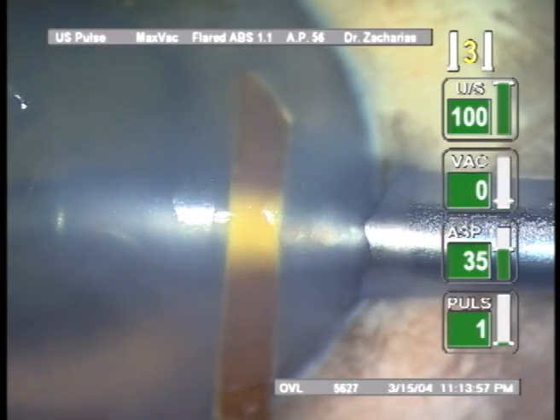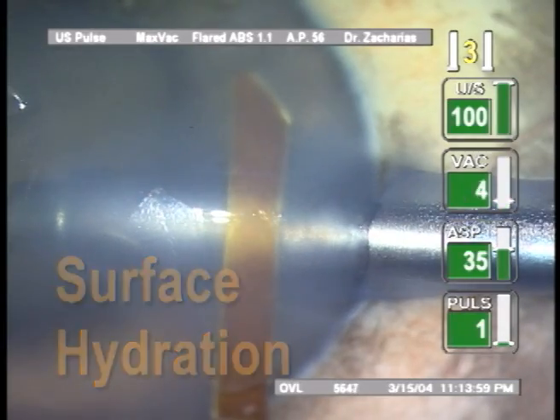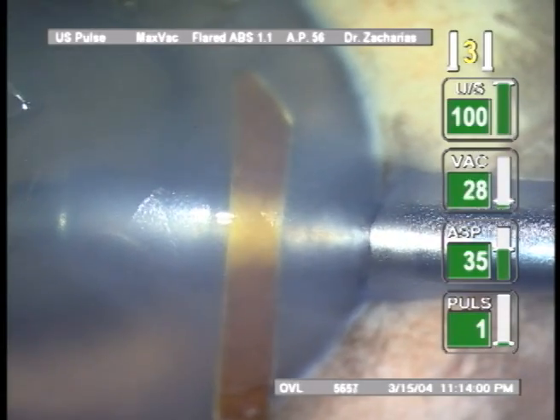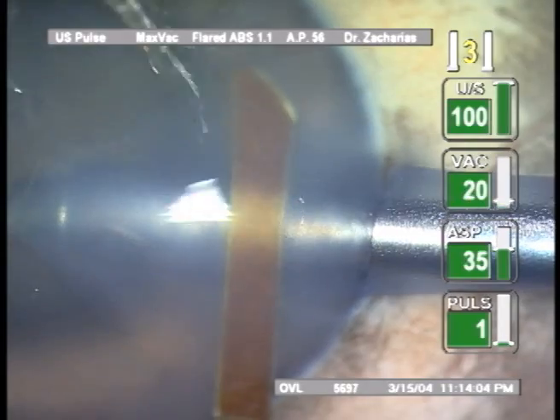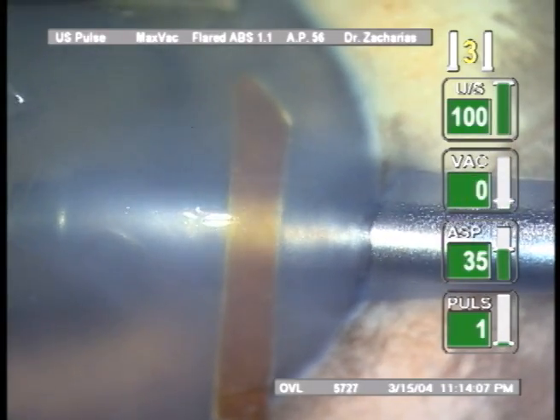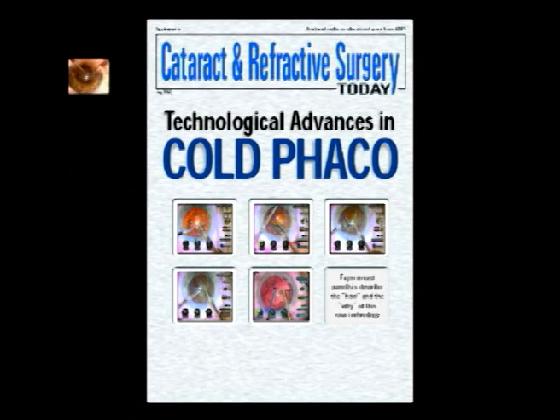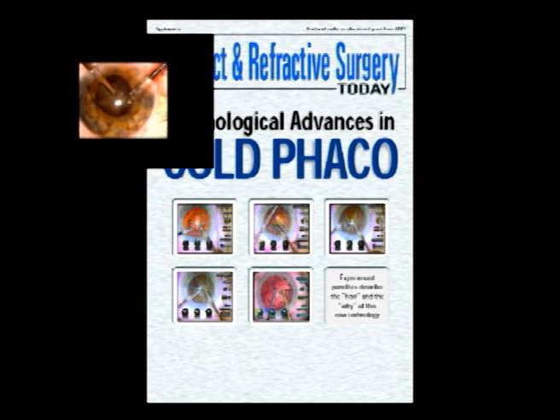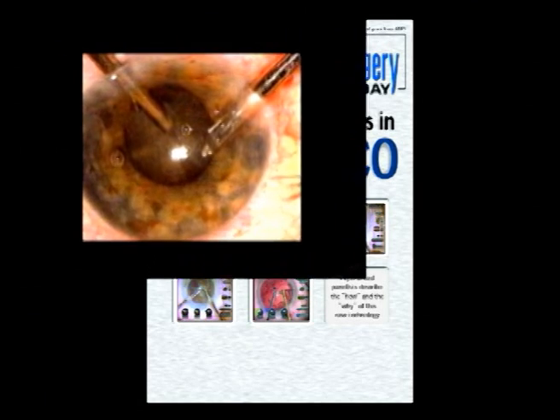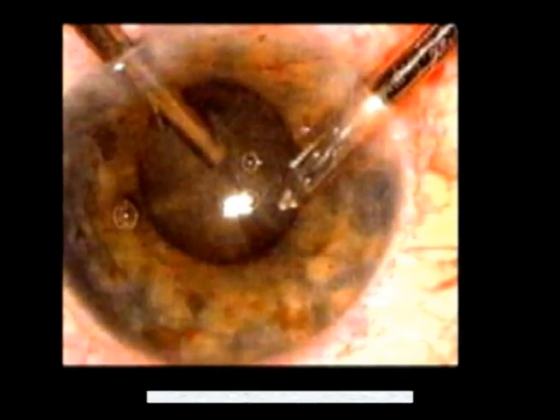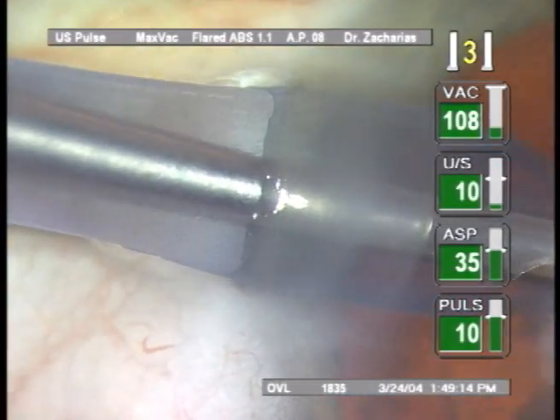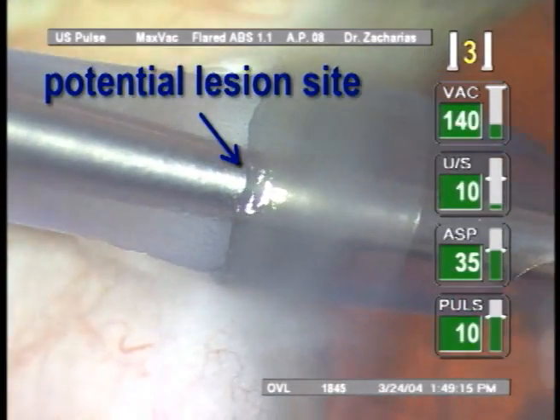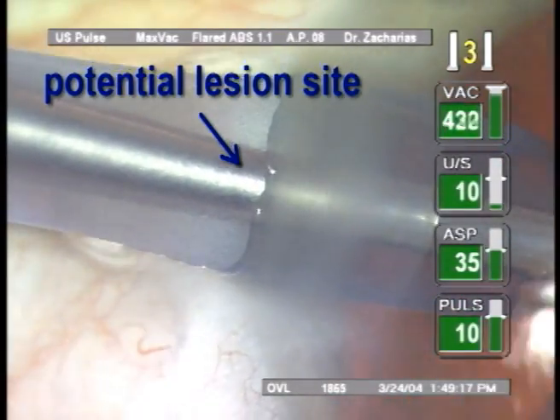A key factor appears to be surface hydration. Our study showed that irrigating fluid at ambient temperature over the incision surface produces an instant cooling and delays the temperature rise observed after irrigation. The observation that sleeveless FACO may allow a safer use of ultrasonic power may be related to our finding that silicone sleeves are highly hydrophobic, promoting wound-lip desiccation.